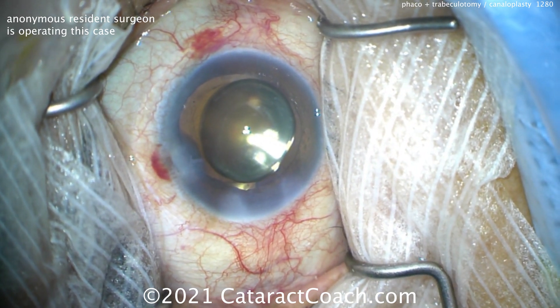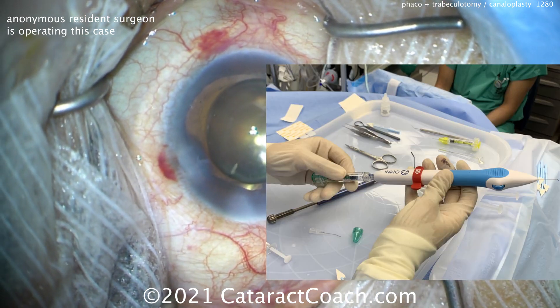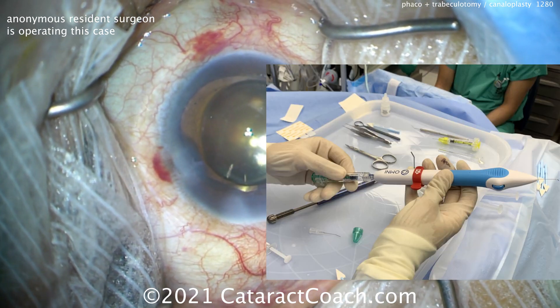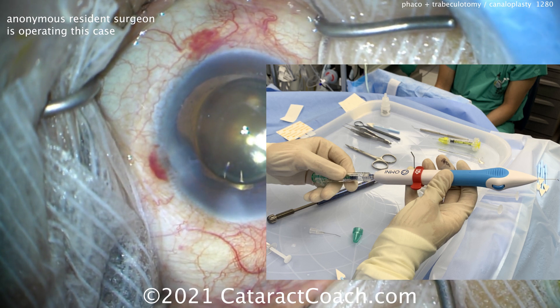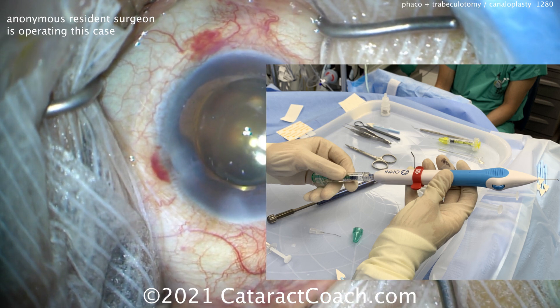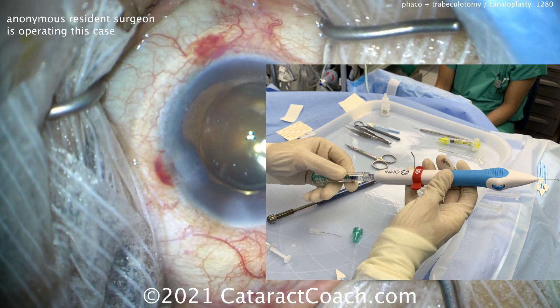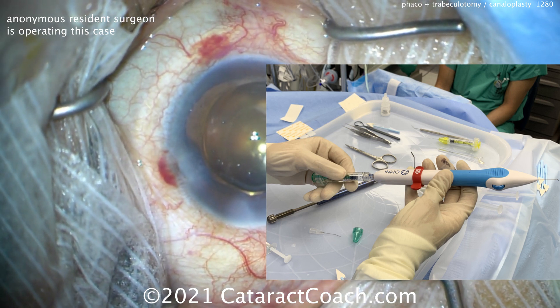Now we're going to need to tilt the patient's head away from us and then tilt the microscope towards us. But first, let's load up our device. So we're using this Omni device. This device first needs to be filled with viscoelastic — there's our cohesive viscoelastic being injected into the port of the Omni device, and this is going to allow us to place little dabs of viscoelastic to perform a canaloplasty.